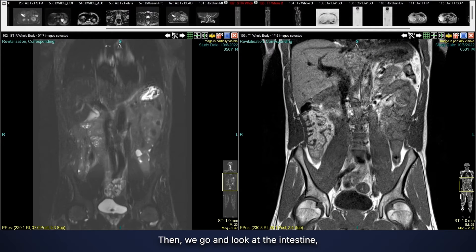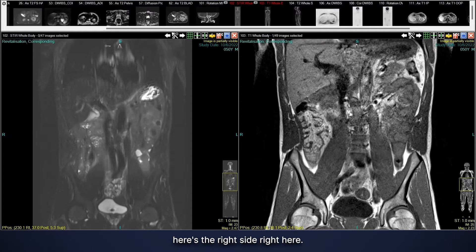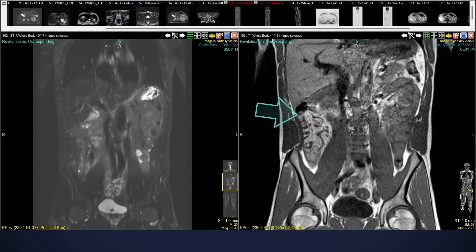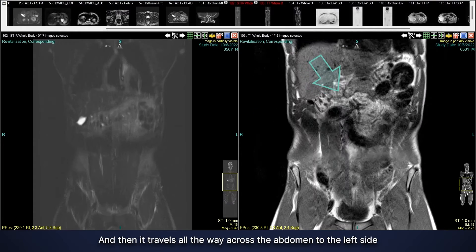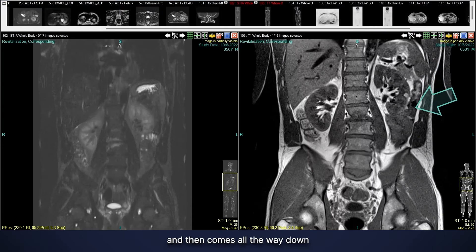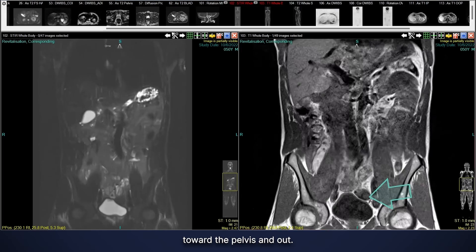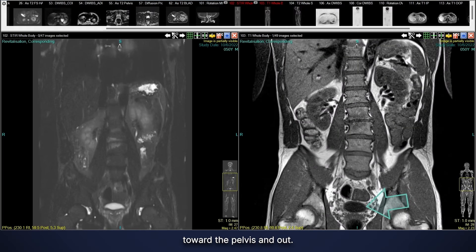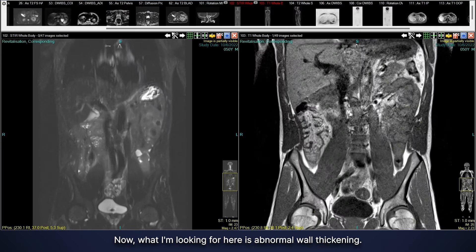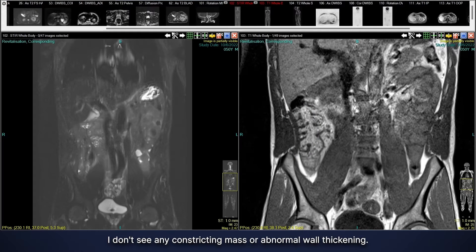Then we go and look at the intestine — specifically the large intestine, the colon. We can see here the right side, and then it travels all the way across the abdomen to the left side, then comes all the way down toward the pelvis and out. What I'm looking for here is abnormal wall thickening. You can see the wall is nice and thin — I don't see any constricting mass or abnormal wall thickening.